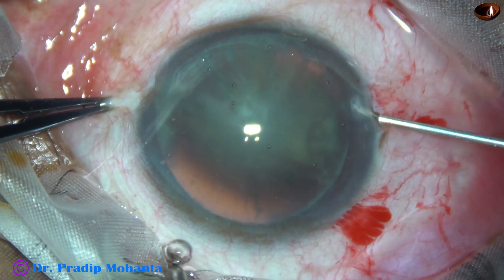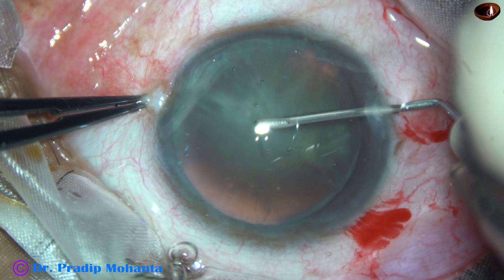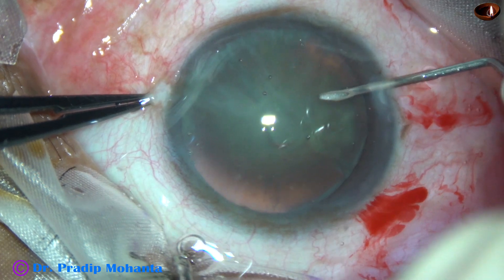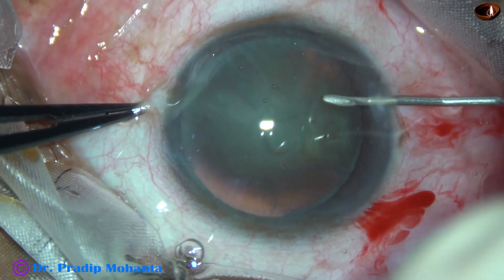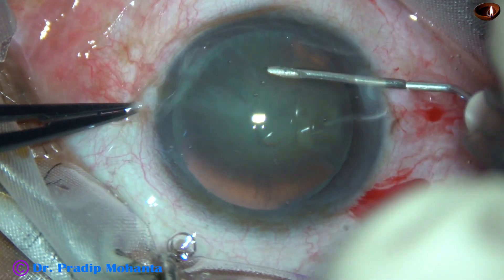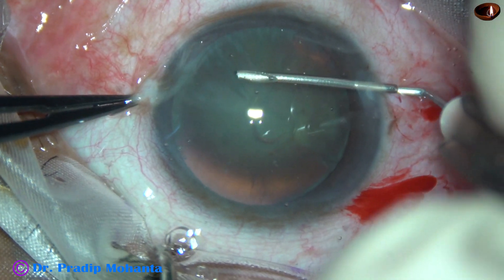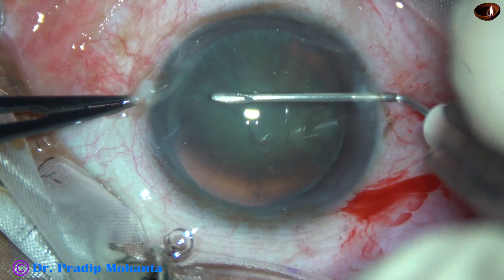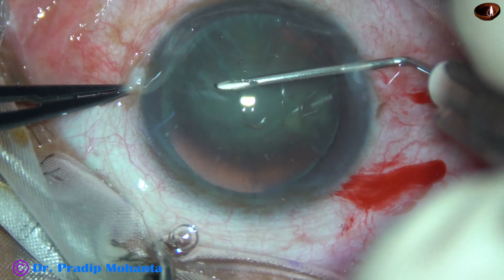Now this is the rhexis. Go through the side port, make a straight cut, pull the capsule, raise a capsular flap, flip the capsular flap, and guide the flap in such a way that you get a rhexis of about 5 to 6 mm.